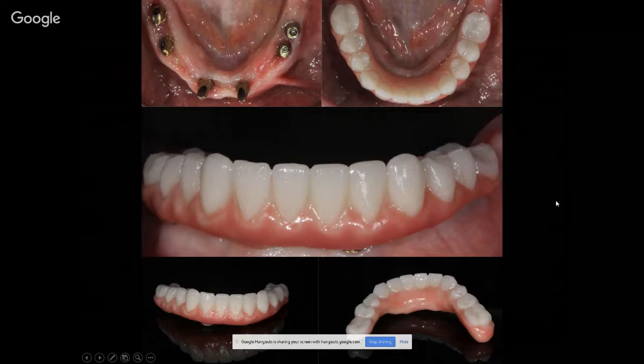I'm actually not doing the restorative for this patient. He's going back to his referral dentist to get the final crowns. He will sit in this for 4 to 8 weeks. And then at the final prosthetic reconstruction, we're going to obviously make some screw access holes because all these abutments, you can see, all the access holes are coming out through the lingual. So this final case will be screwmentated down. The zirconia will be milled with screw access holes across, cemented with permanent cement, so that this is retrievable.